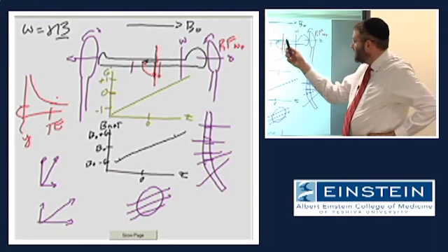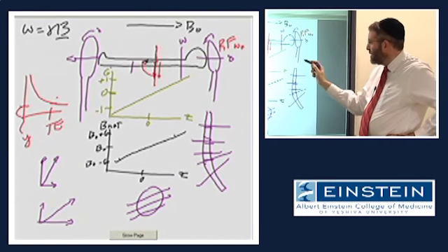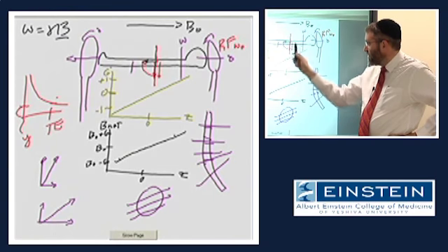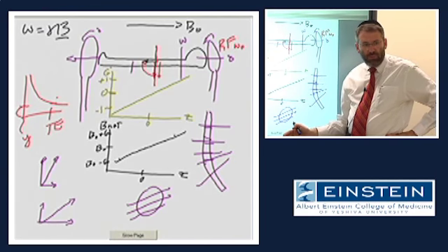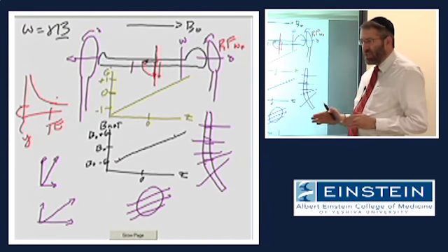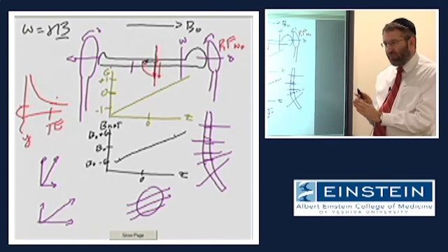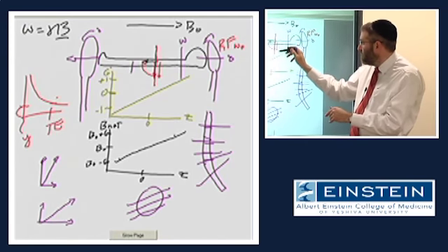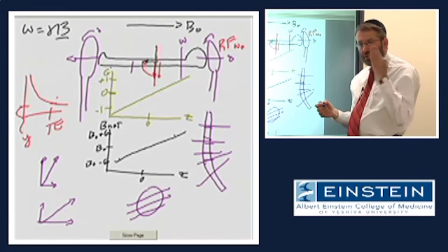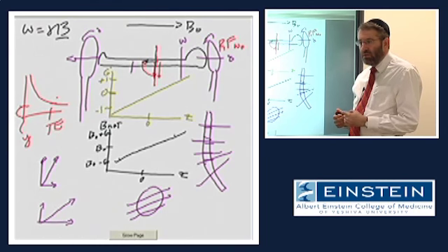In our first example, where we transmitted our RF at the Larmor frequency in the presence of this Z gradient magnetic field, we said that we select the spins that are at isocenter. That sounds to me like the spins which are precessing at exactly the same frequency as the transmitted RF, lined up along some plane at isocenter, are the ones that are going to be excited, tipped into the transverse plane, and are going to generate our detectable signal.